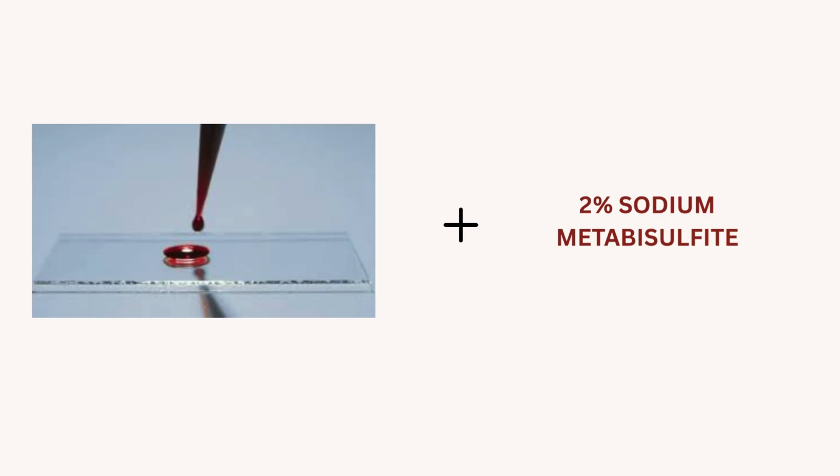Wipe off the excess sample. Using a syringe and a 19 gauge needle, carefully rim the cover glass with petroleum jelly, completely sealing the mixture under the cover slip. This prevents evaporation or drying up of the sample.